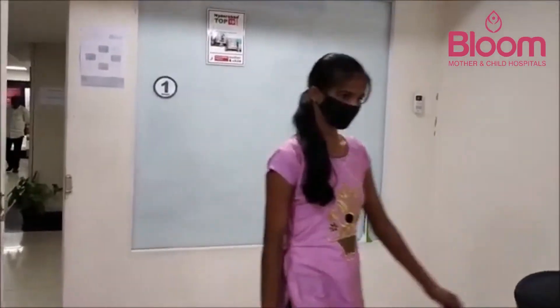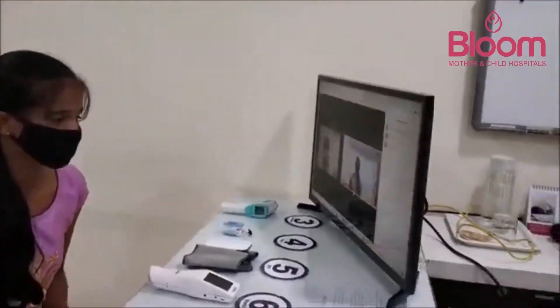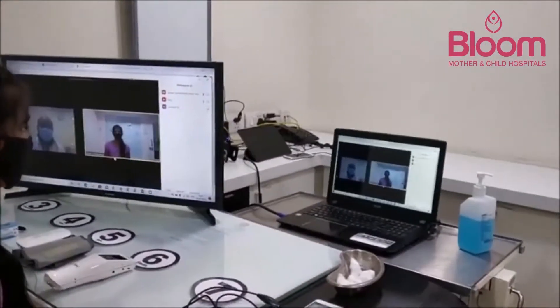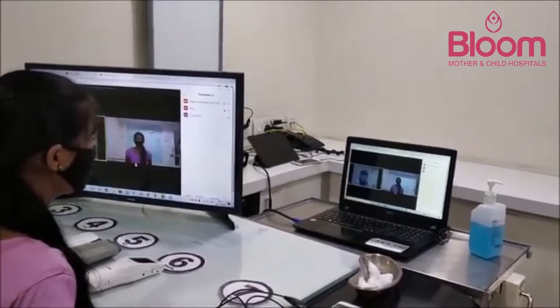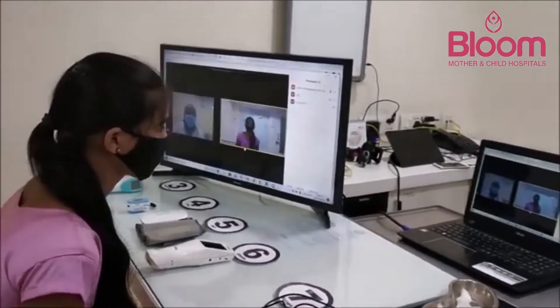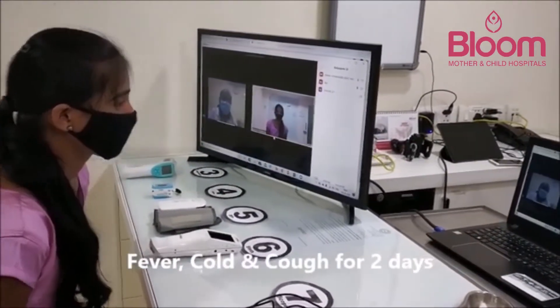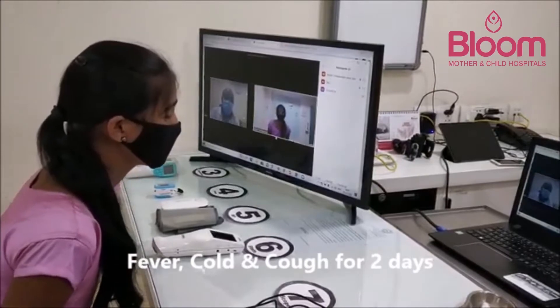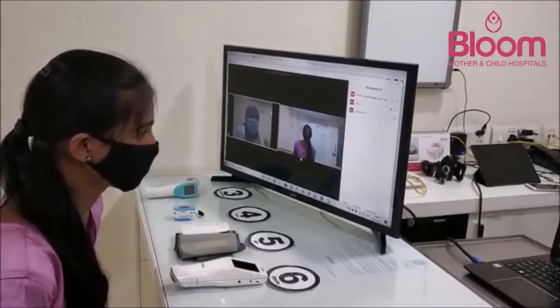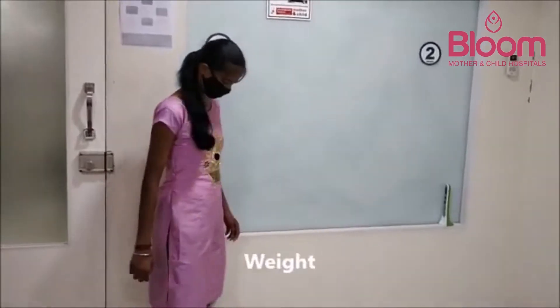We will now see how a patient enters the clinic. The patient takes their seat and starts a conversation with the doctor. The doctor asks which language the patient speaks, and the patient responds in Hindi. The patient then proceeds to station one.